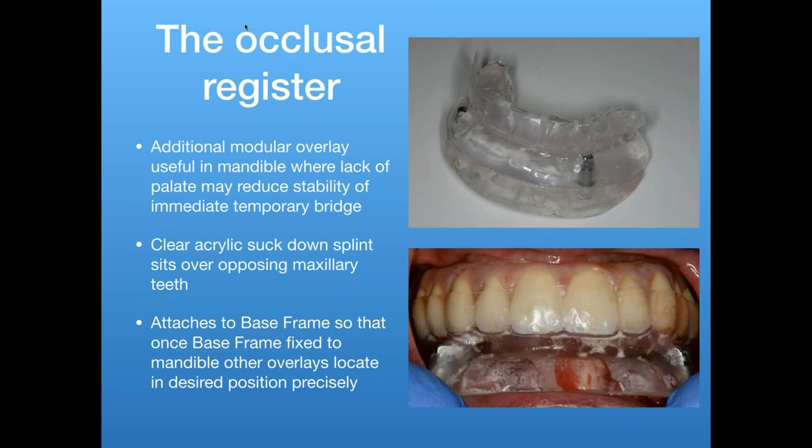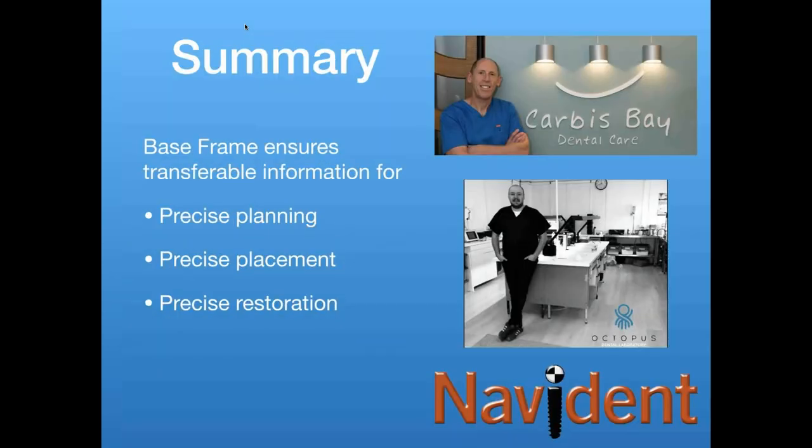This new modular overlay that I've just started using helped to locate the lower full arch base frame, where we have a full upper, and in this case, a full upper fixed bridge. And it's a bit like a suck down splint that links onto the base frame and locates everything in position as we want it.